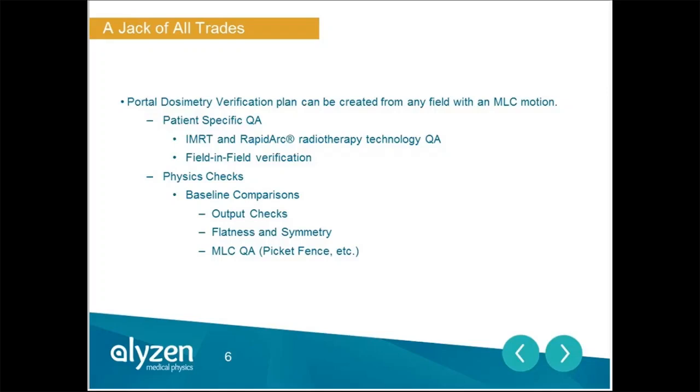and verify that some of my MLC parameters in the treatment planning system are still valid, maybe after some sort of PMI or repair by the service engineer. I find portal dosimetry to be extremely useful for those kinds of things.